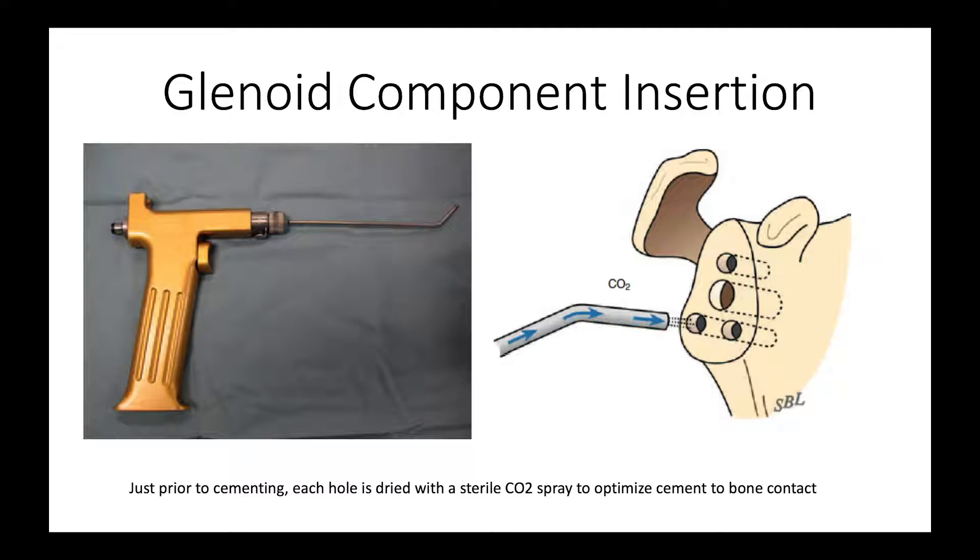Once we have all the holes drilled, we're ready to cement. We like to use sterile CO2 spray, and right before we cement each hole, we blast it with the CO2 gun and blow all the fluid and debris out of the hole, then pressurize the cement in that hole. We repeat this for each hole, giving us a nice clean bone well with no fluid or debris that may compromise the fixation. Any fluid — whether saline, blood, or any other kind — will interfere with the secure fixation of the bone cement to the bone.